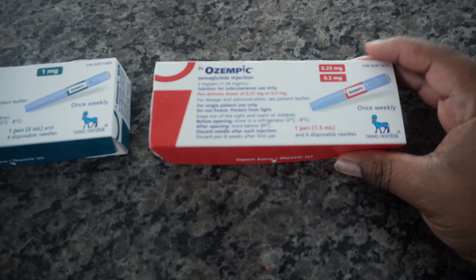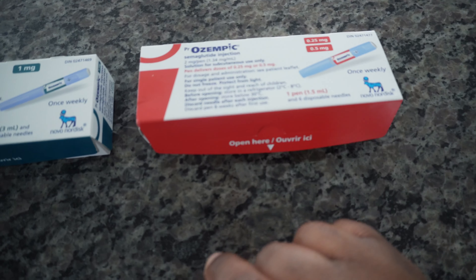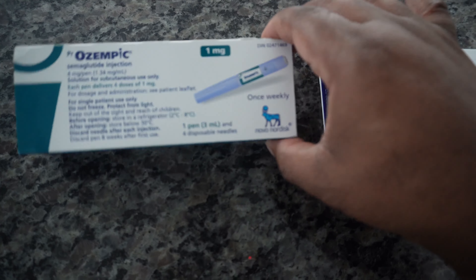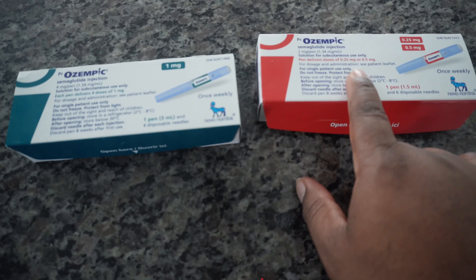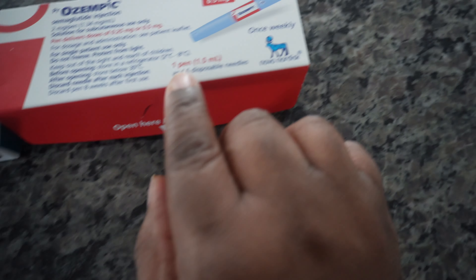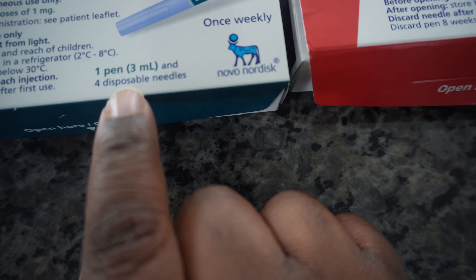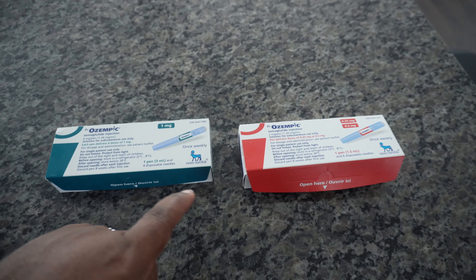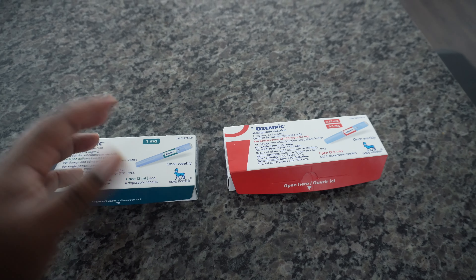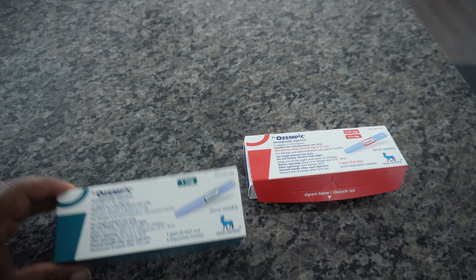So here you have your 0.25/0.5 doses of Ozempic, and over here we have the one milligram dose. This pen is double the size of this one. It comes with six disposable needles versus four on this one. These actually cost the same price — I thought because this box is double the size it would be double the price, but it came in at the same price.